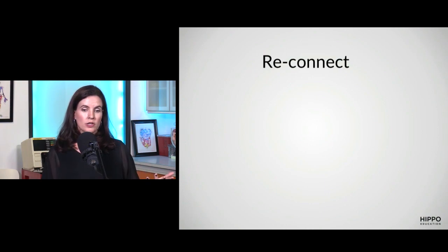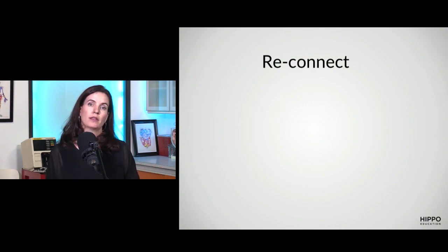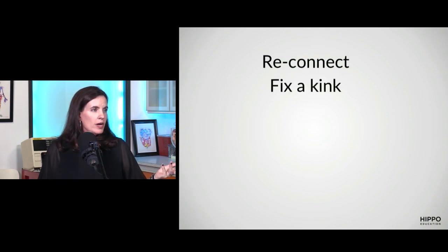So say the patient's endotracheal tube has become disconnected from the vent tubing, you could stick the two ends together and reconnect them. Easy win. I like that. Easy win, right?